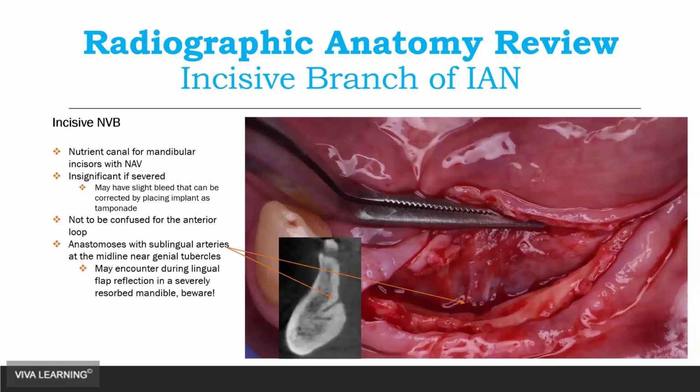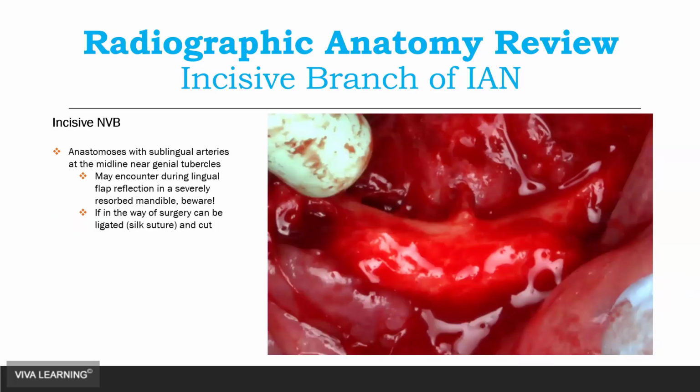You saw the videos earlier of a bleed from inside the bone that's easily stopped by placing the implant or gel foam or bone wax, whatever. Cutting an artery that's in the soft tissue can retract under the floor of the mouth and cause a life-threatening issue.